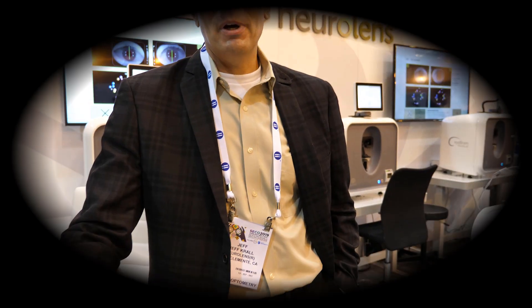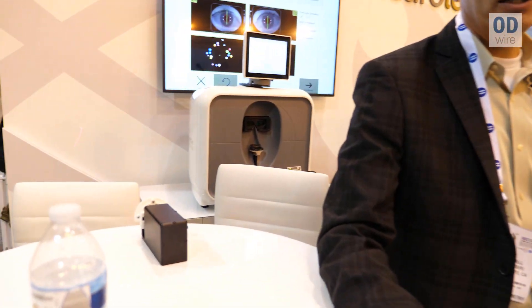Well Adam, thanks first of all for stopping by. In the background you can see the Neural Lens Measuring Device, and what it does is actually measures how our eyes work together in a dynamic way.